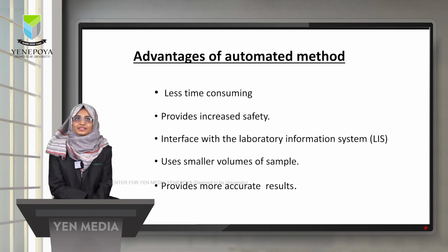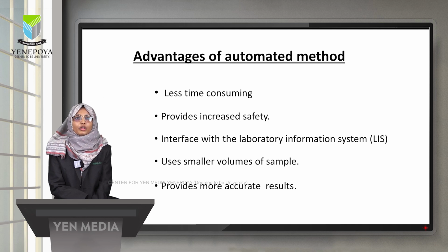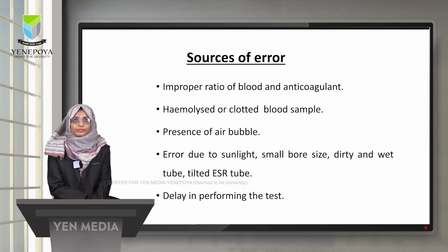Advantages of the automated method: less time consuming, provides increased safety for the technician, interfaces with the laboratory information system, that is LIS, uses a small volume of sample, and provides more accurate results.